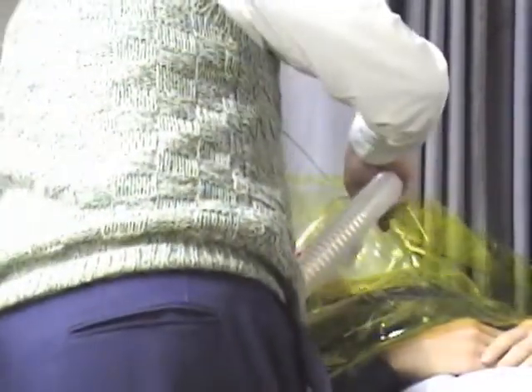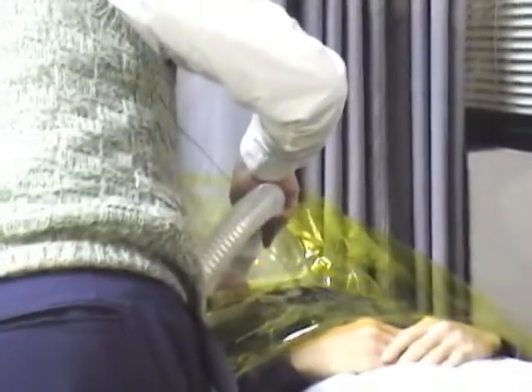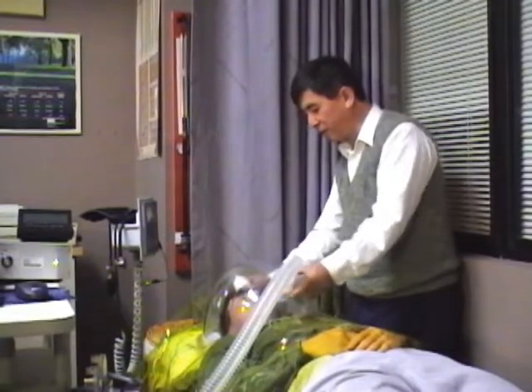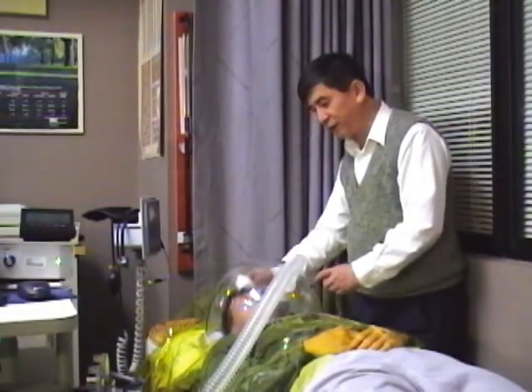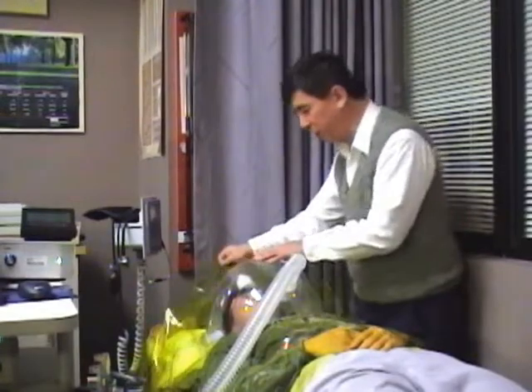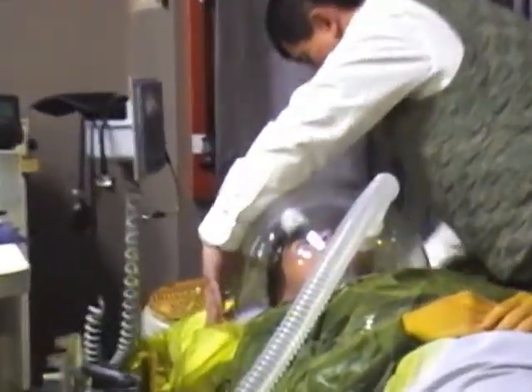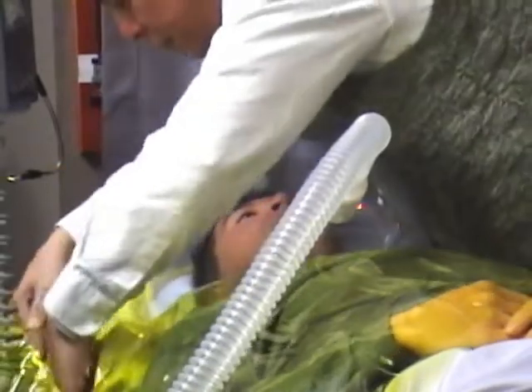connect the tube to the canopy to pour the air out. We cover the canopy with the top part of the canopy still stay on top of the pillow. Wrap the drape around the pillow so it's airtight.